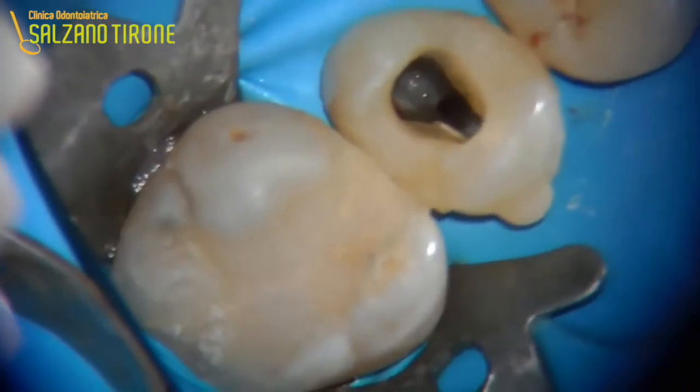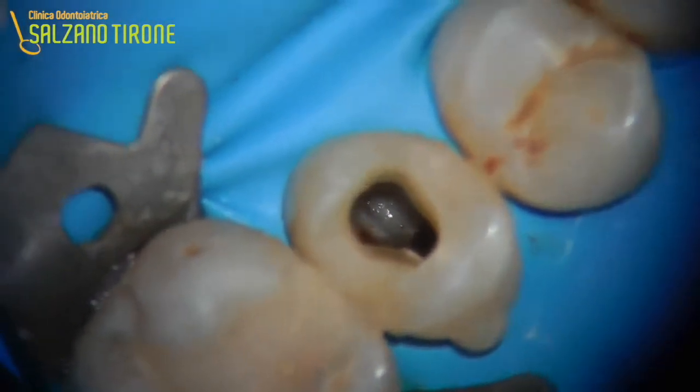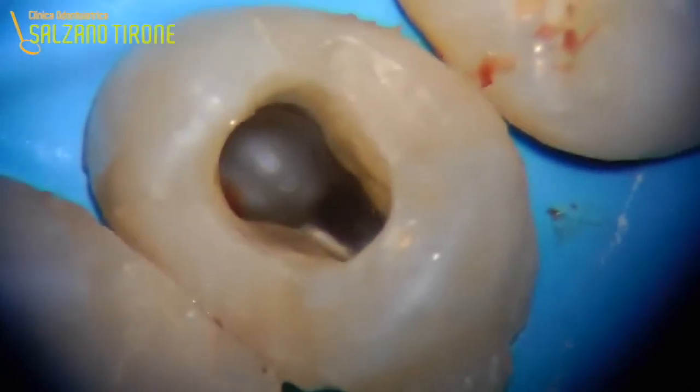Here we can see the two perforations. Look how well you can see with the microscope. That's the perforation on the palate we expected, but there's no granulation tissue anymore, and you can see how clean and shiny the tissue is all around. And this is the distal perforation where it touched the periodontium. When we get to a situation like this, we are ready to fill the defect.